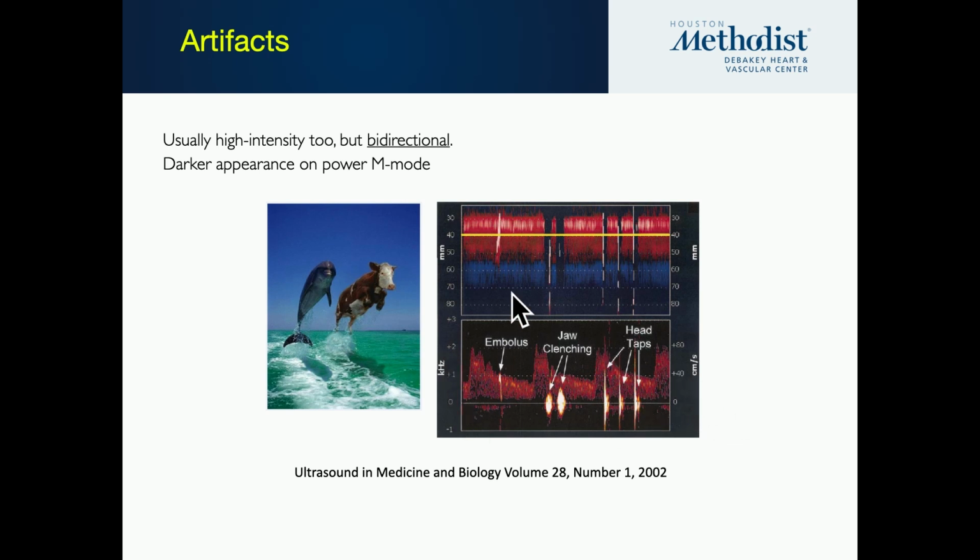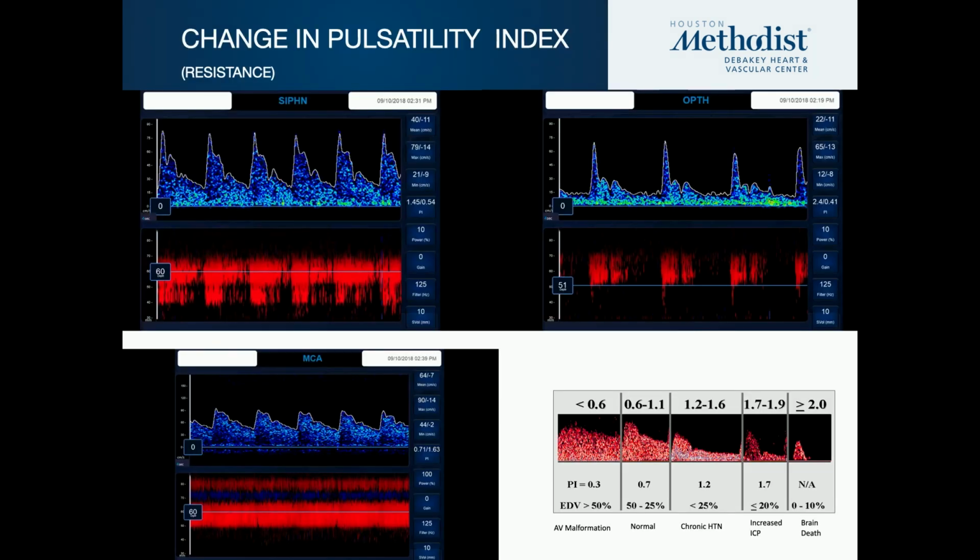So this spectrogram is always coming from where the yellow line, the depth, is recognized. So out of the 33 M-mode channels, we are recording just one. You only listen to that one channel when you hear the spectrum and those bubbly sounds. And you're going to hear some bubbly sounds. These are some new screens from my new machine. Again, the same M mode is coming from a Spencer machine, but these are just new colors.